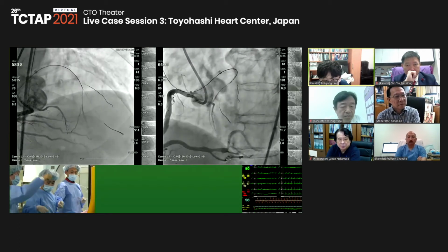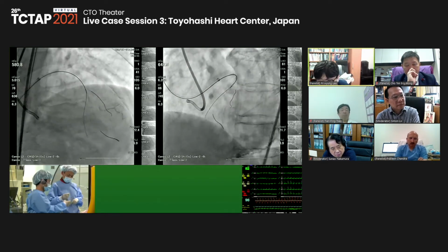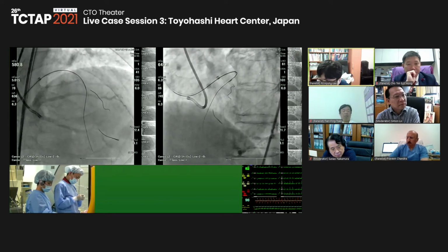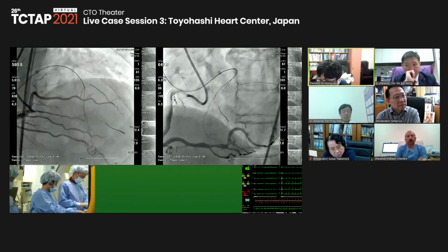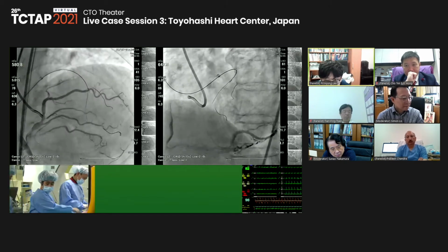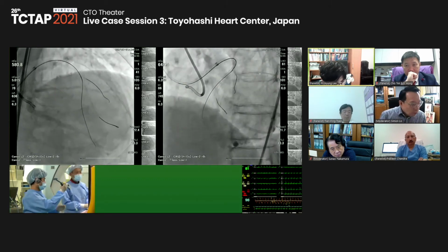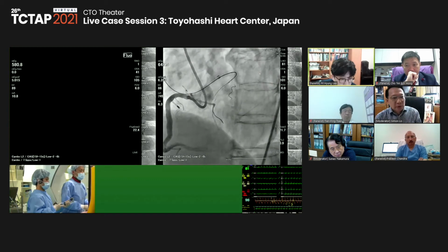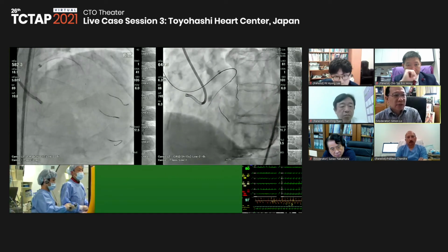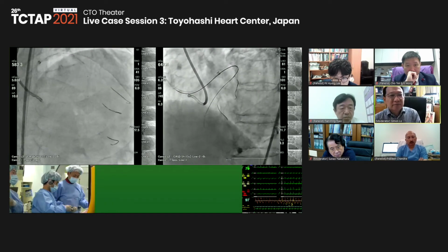So the current situation at the distal LAD may be a negative remodeling or maybe a combined disease. So differentiating that finding with the IVUS would be important to make the stenting strategy and stenting location. Yeah, absolutely. I think the IVUS would also tell us whether the ostium of the diagonal is calcified or not.